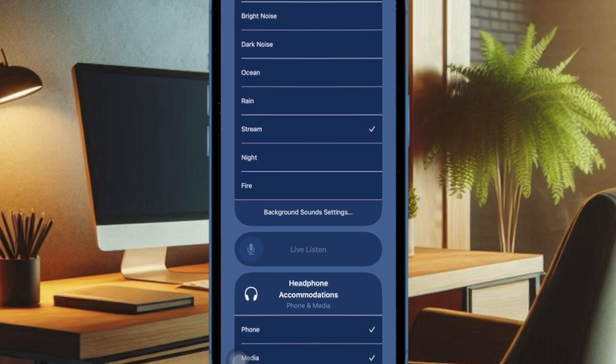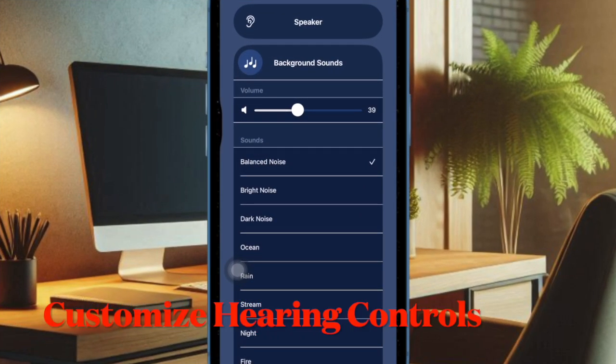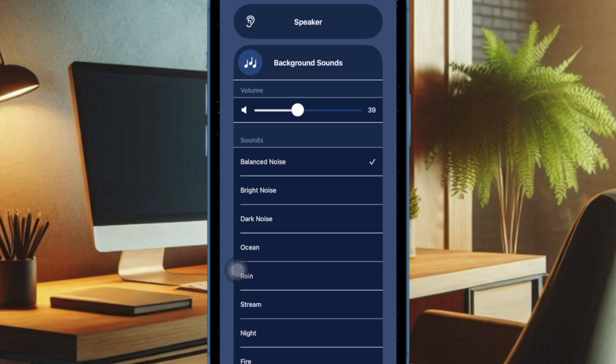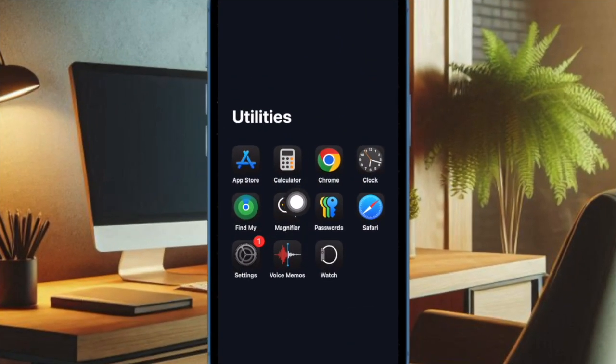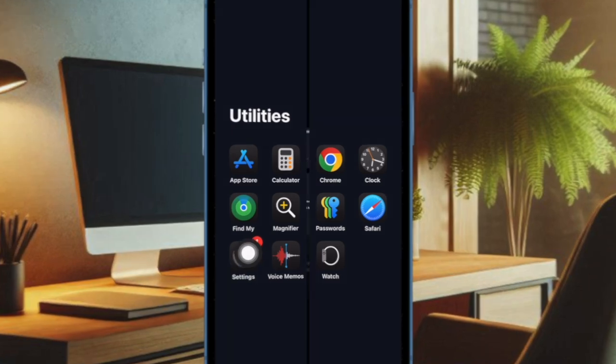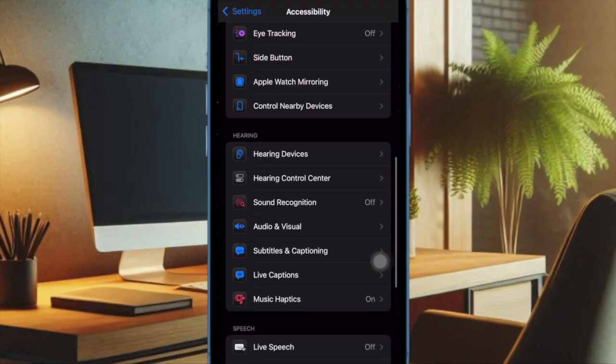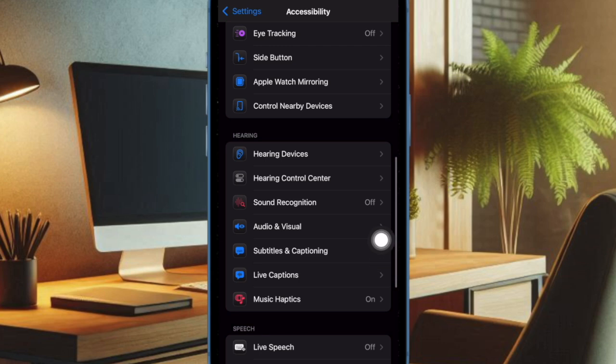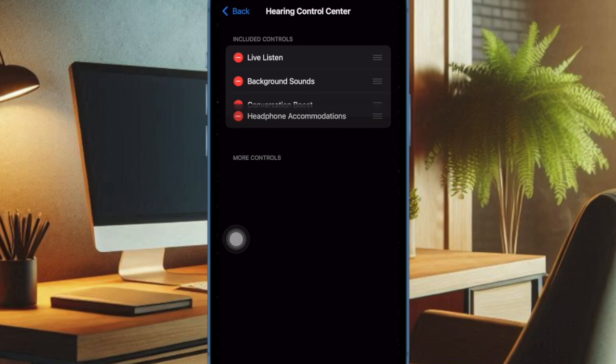For a more personalized experience, you should make sure to fully customize your Hearing Control Center as well. To do so, open the Settings app on your iPhone, then select Accessibility. Then scroll down to the Hearing section and choose the Hearing Control Center option.